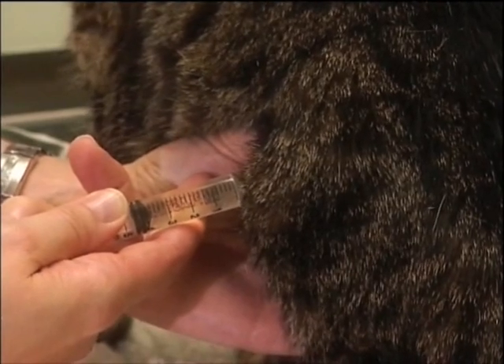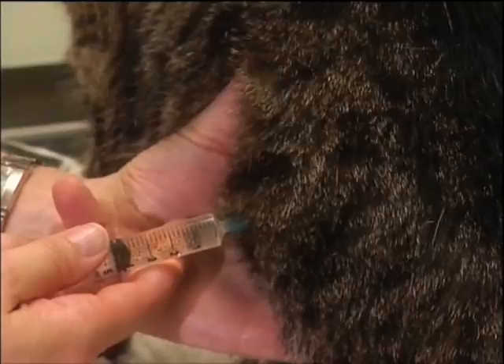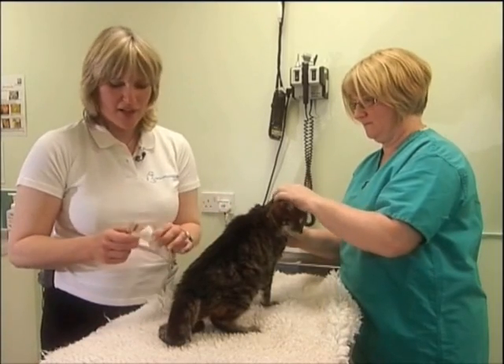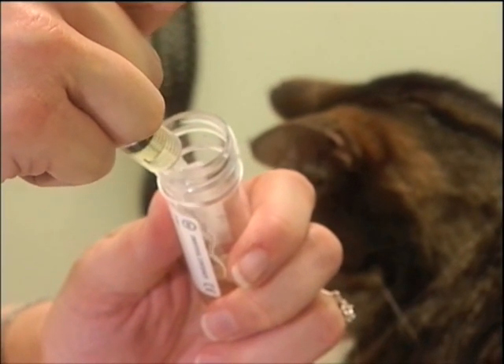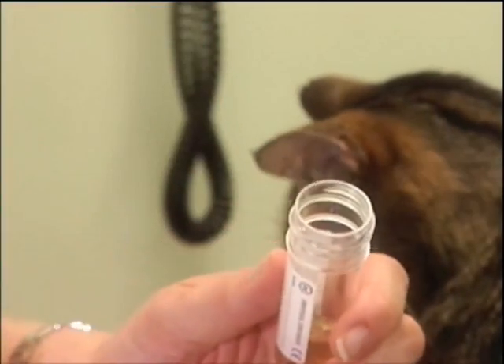Once I've collected my sample, I release my hold on the bladder and withdraw the needle. My sample is then ready to place in a collection tube. Five mils of urine is generally adequate to do all of the tests that need to be done.